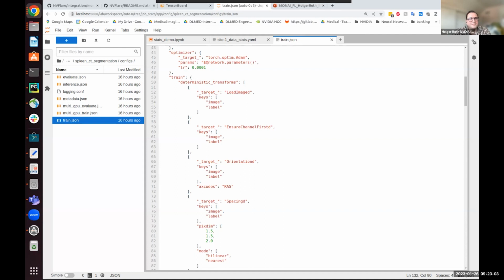Those are again active research areas. There's this straggler concept and ideas of using asynchronous updates of the global model, so the client updates might come in at different times. What I showed today was mainly the standard federated averaging workflow, which is synchronized. So it waits for a certain number of clients and then averages, instead of, like you said, asynchronously merging whenever possible. Right, exactly. Got it.